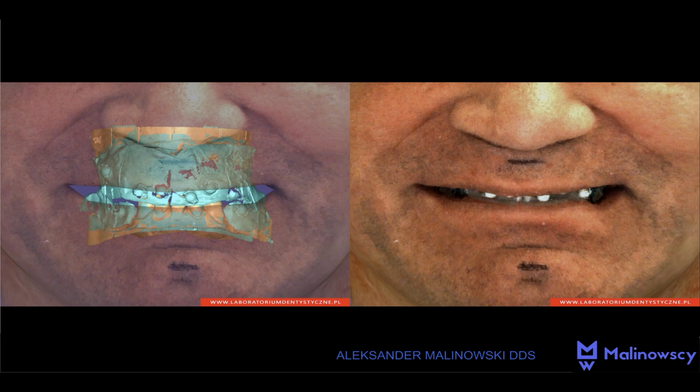Here we see how at that time we were transferring the position of the processes to the facial scan. It was relatively effective. On the wax pattern, we would attach plastic beads of a known size, which we adhered to the wax pattern. Then we send the facial scan along with the pattern and the intraoral scans to the laboratory.